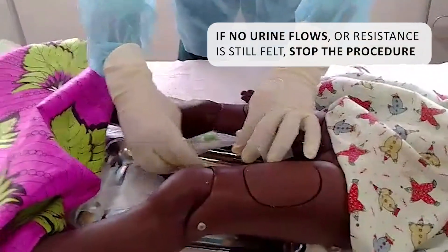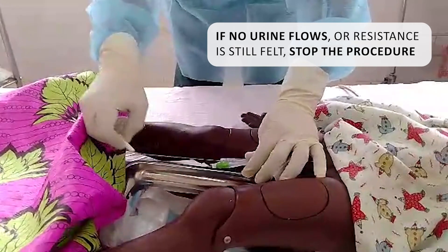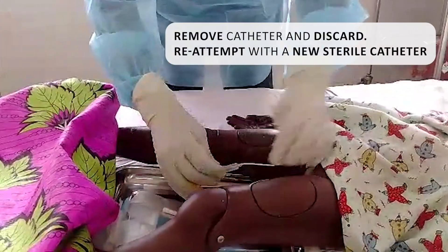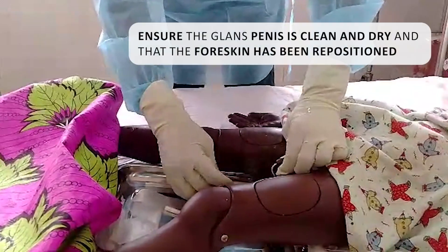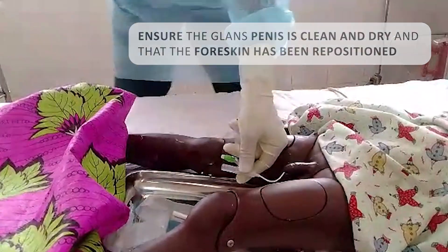If no urine flows or resistance is still felt, stop the procedure. Remove the catheter and discard. Reattempt with a new sterile catheter. Ensure that the glans penis is clean and dry and that the foreskin has been repositioned.